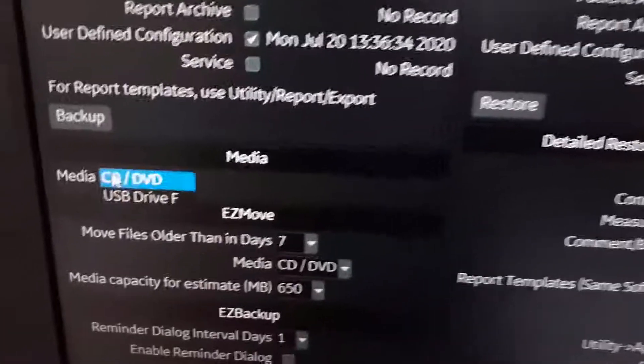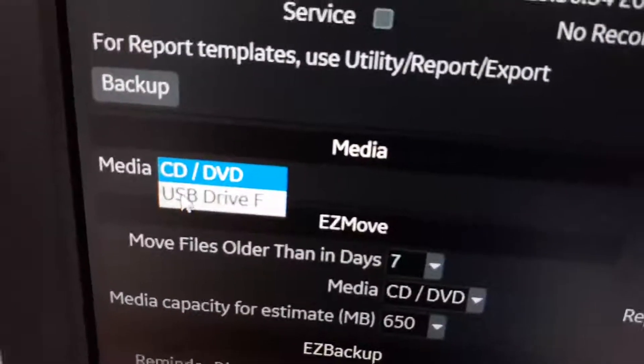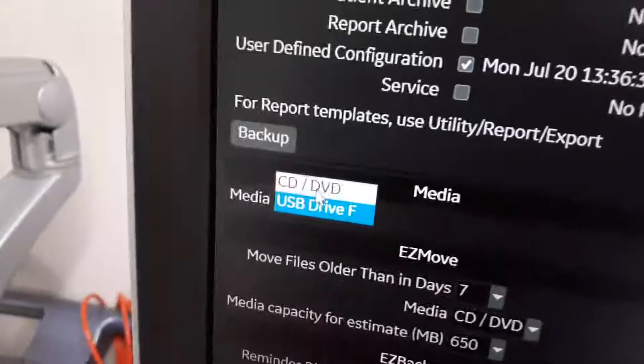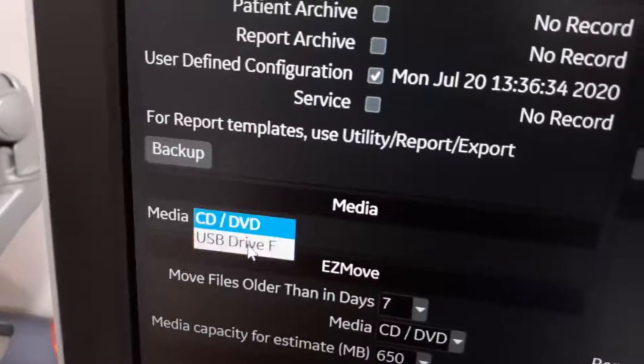Then choose the destination — here we'll select USB Drive. If you have a CD, you can use the drive for CD/DVD as well. I'll choose USB Drive now. You can plug the USB in the front or on the back of the machine.